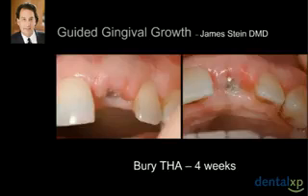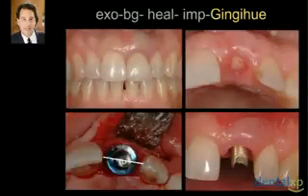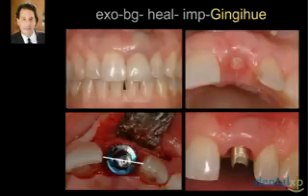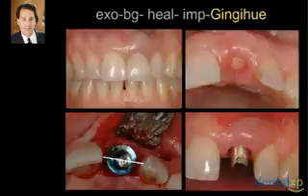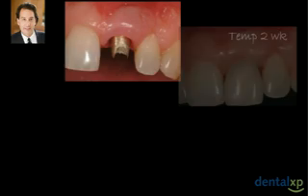Four weeks later, soft tissue has healed and a longer abutment will be placed. We did something in this case called guided gingival growth, where the temporary healing abutment was placed slightly beneath the soft tissue, allowing the soft tissue to heal over the abutment. This is a technique I learned from James Stein, a prosthodontist in Boston. Here, the implant has been uncovered, a provisional or permanent abutment has been placed, and the provisional restoration — in this case a GingiHue abutment by Implant Innovations — has been seated.